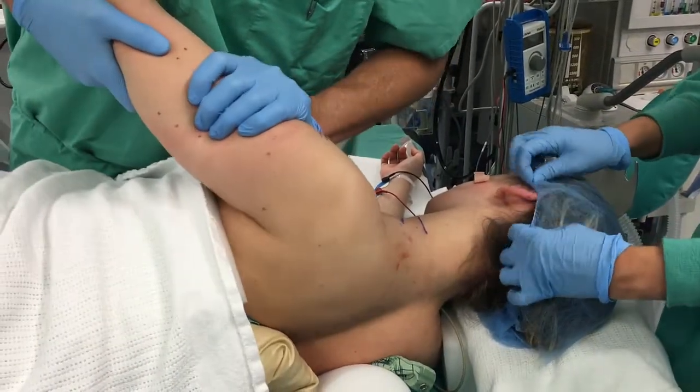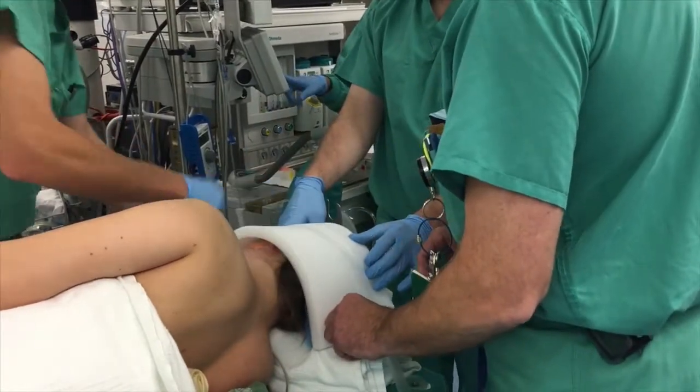At this point, it is appropriate to examine the affected shoulder under anesthesia. A piece of foam padding is placed over the side of the head to protect the patient's face.